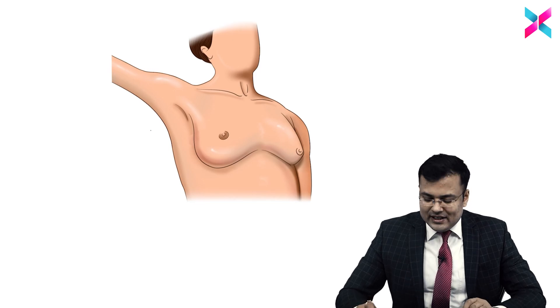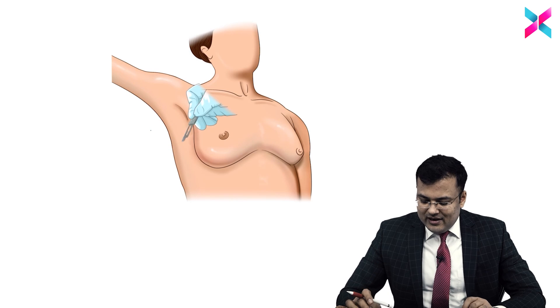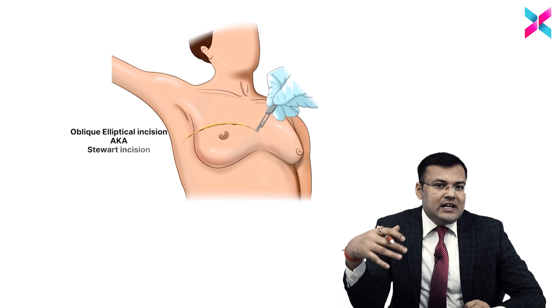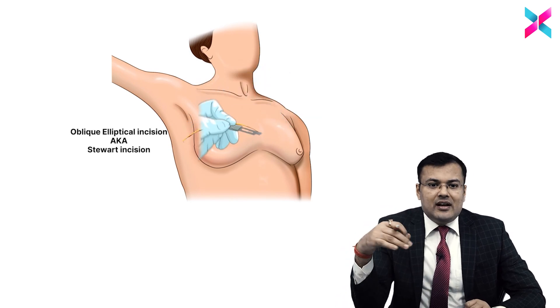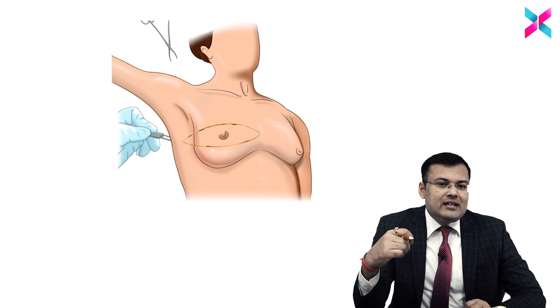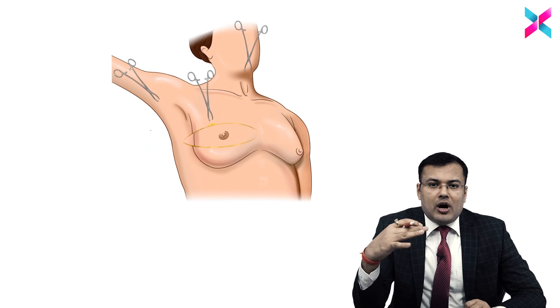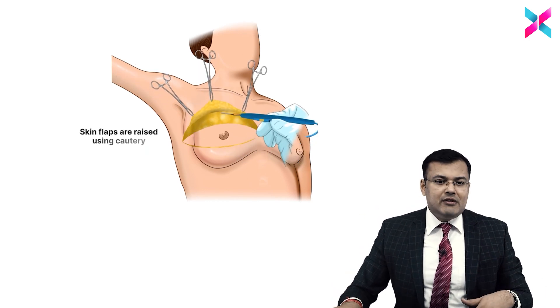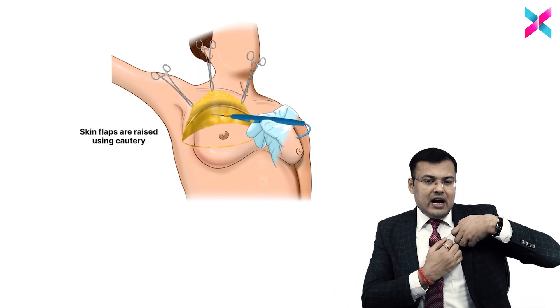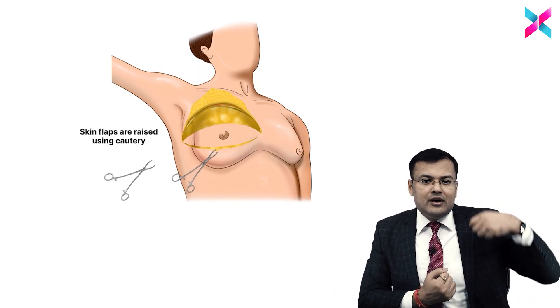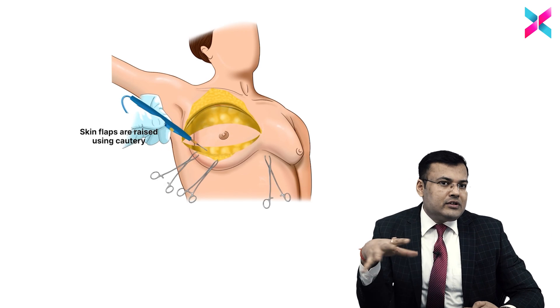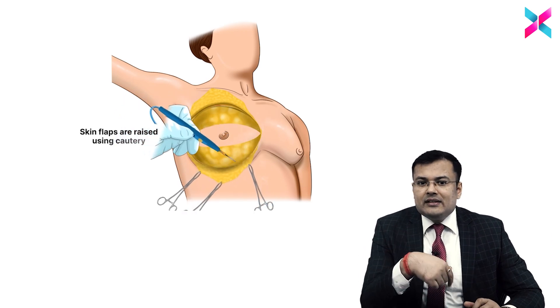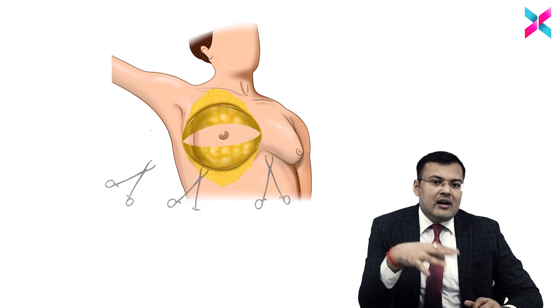Now, see how we perform mastectomy. First, we are giving this kind of elliptical incision, also known as the Stewart incision — an oblique elliptical incision. After that, we are going to raise the skin flaps. You can see we are using Ellis tissue forceps, raising the skin flaps with the help of cautery.